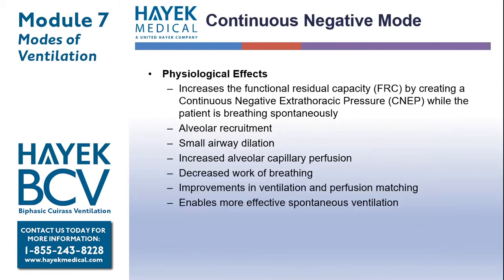Physiologic effects: increases the functional residual capacity by creating a continuous negative extrathoracic pressure while the patient is breathing spontaneously. Affects alveolar recruitment, small airway dilation, increased alveolar capillary perfusion, decreased work of breathing, improvements in ventilation and perfusion matching, and enables more effective spontaneous ventilation.